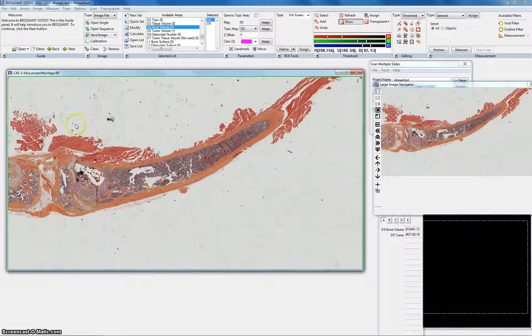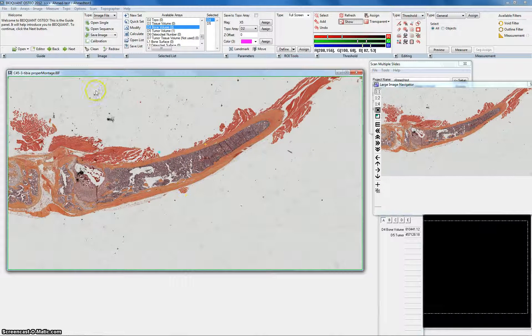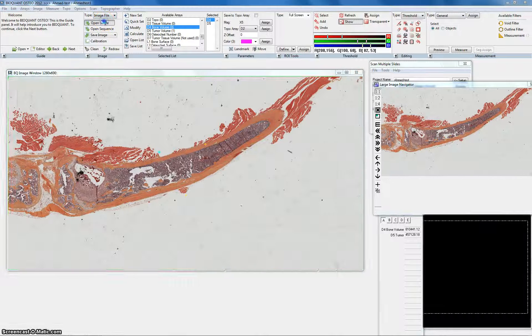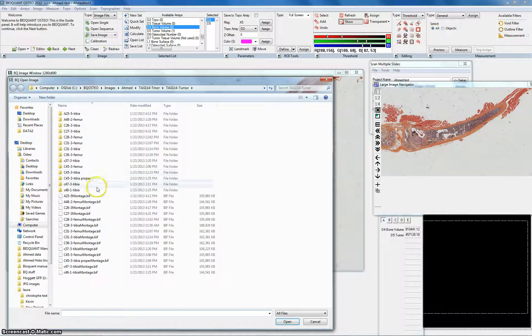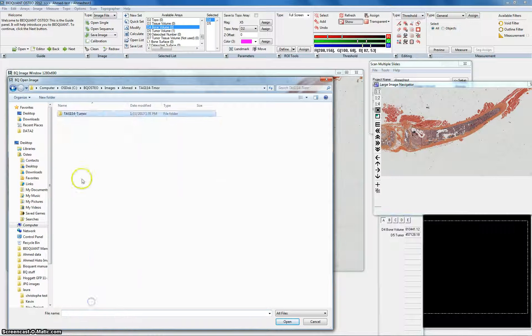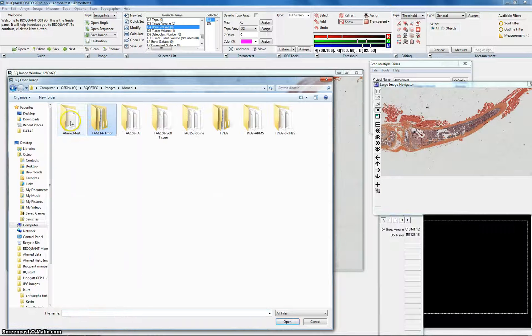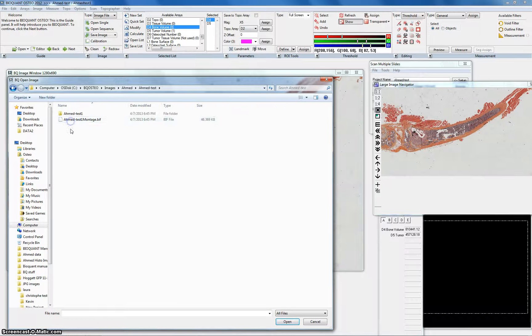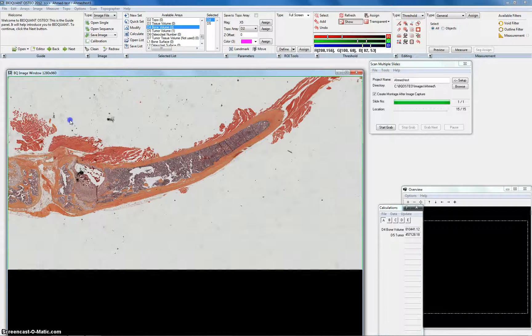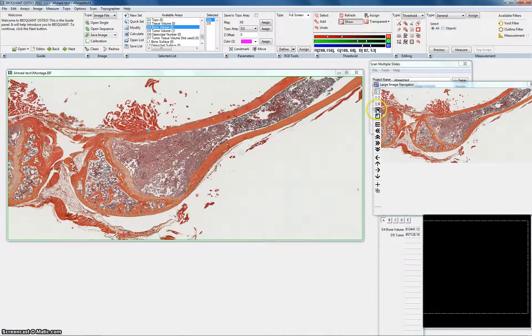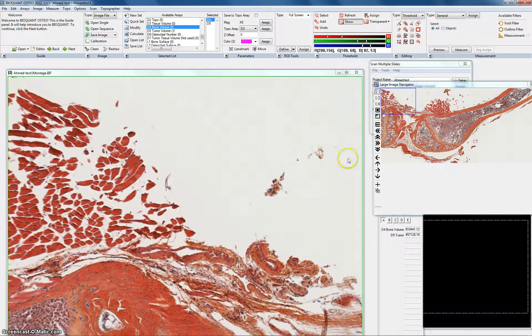Hi, this is Ahmed. Now I'll show you how to do the analysis on BiQuant. I'll get the image that we just picked. Ahmed test. This is the montage that we worked on earlier.